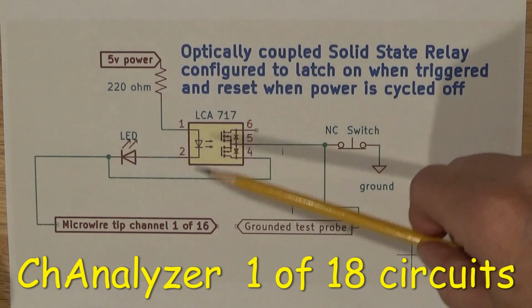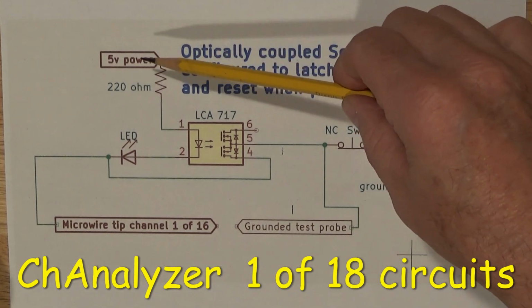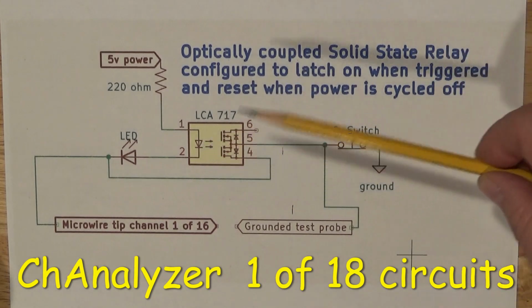So this is the basic schematic. This is one of 18 channels on the ChAnalyzer. It runs on 5-volt power. It's got a solid state optically coupled relay, which is the heart of the device.